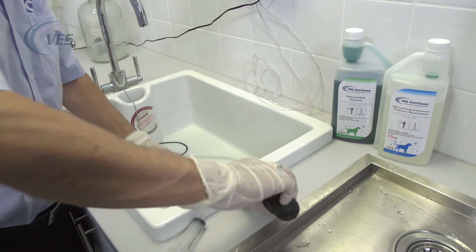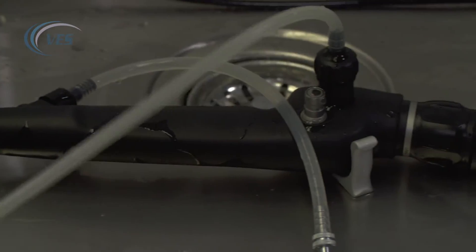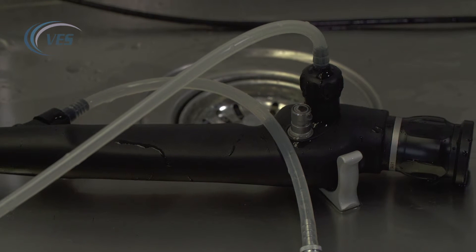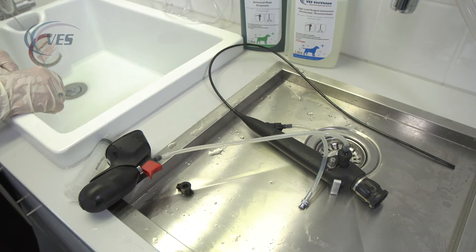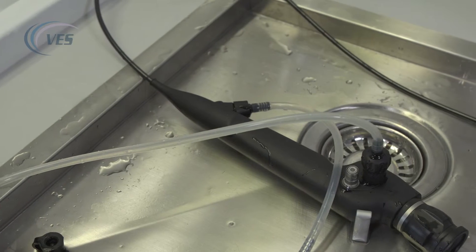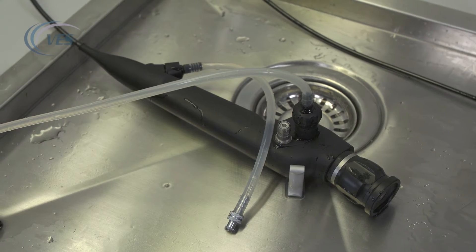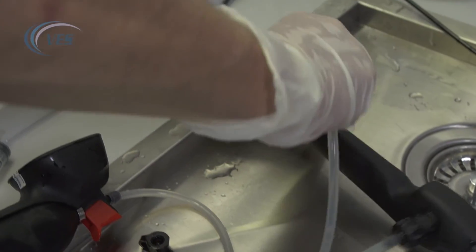We then remove the scope again, dispose of the disinfectant, and flush through two or three times with clean water. It doesn't have to be distilled water or deionized water, but if you use something like a Milton sterilizing fluid for your final flush through, that will be absolutely fine.